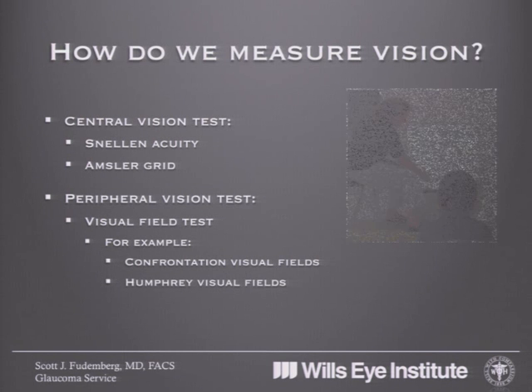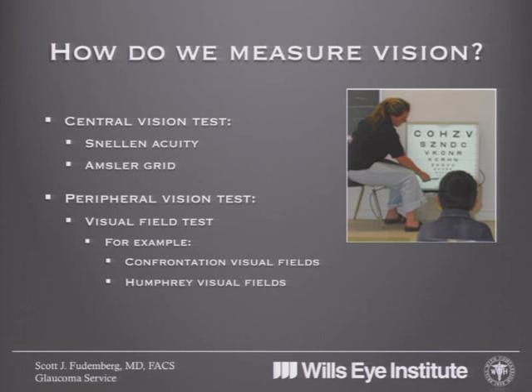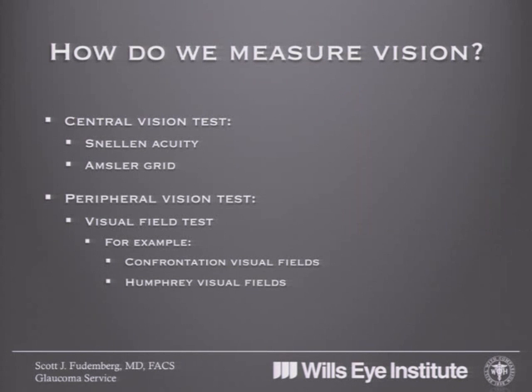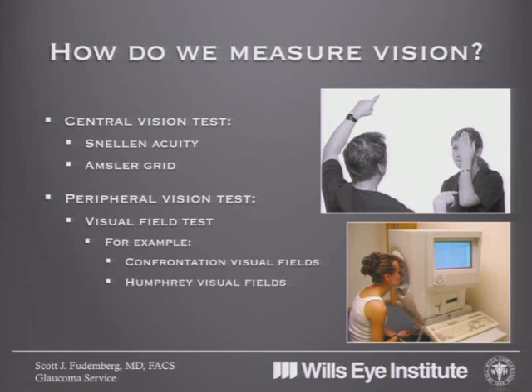So when we measure vision, we measure the straight-ahead central vision with eye charts like the Snellen acuity chart. Or particularly if you have retinal problems like macular degeneration, you may be familiar with the Amsler grid, where we are looking for changes in central vision that might be as subtle as just wavy lines. Whereas with peripheral vision, we often test by a couple methods. One is by facing an examiner and keeping one eye closed, we can measure your peripheral vision by what we call confrontation, where a simple target is shown, like a hand or some fingers, and that can give us a rough estimate of whether or not the visual field has been affected. That's a rough visual field test, and it's easy to do.